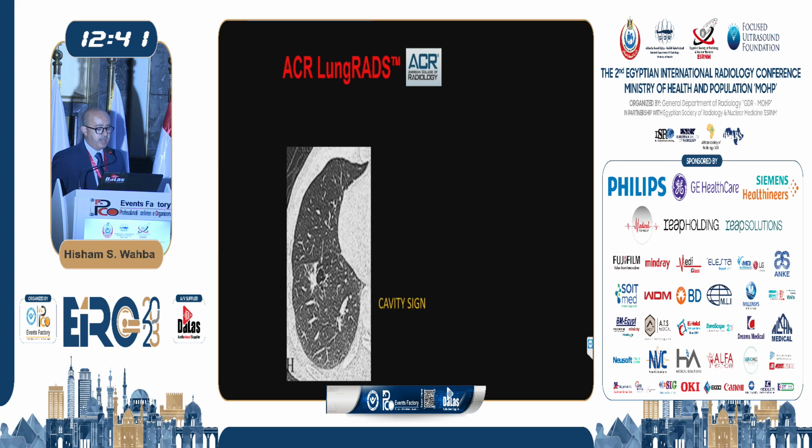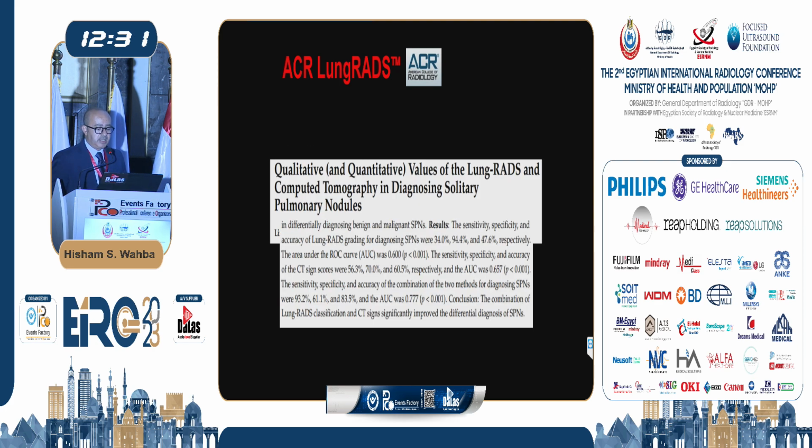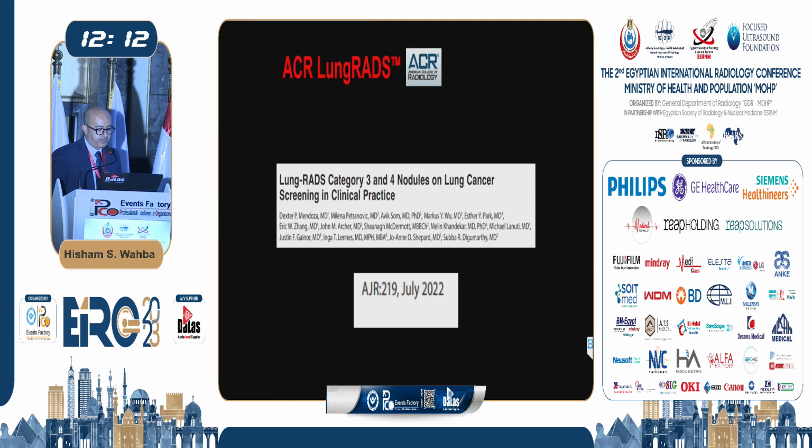The vacuole sign, the cavity sign, and this is an important point because later on they started to introduce the cavities and the cysts in the Lung-RADS as well. And in this study, they said that the combination of the Lung-RADS per se and the CT signs of each and every single nodule increased the sensitivity of the reporting, and they said they should look upon the size and the shape of the nodule itself.